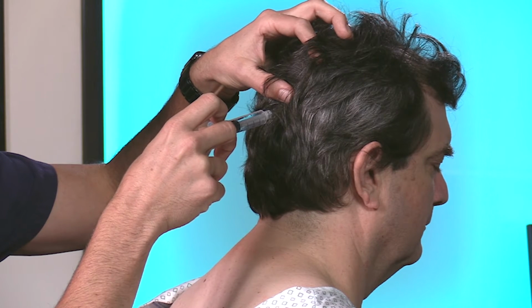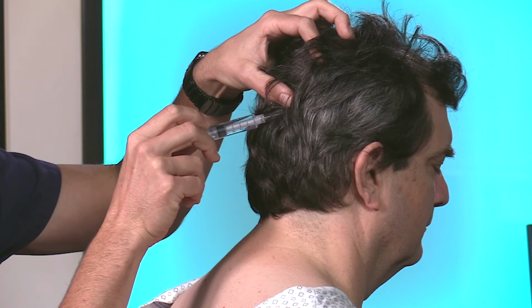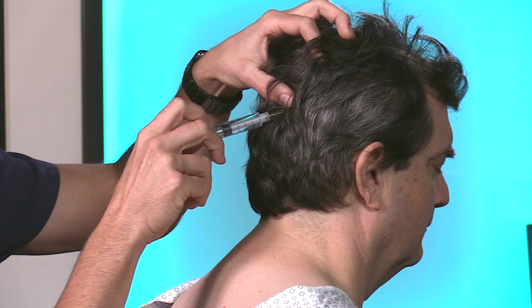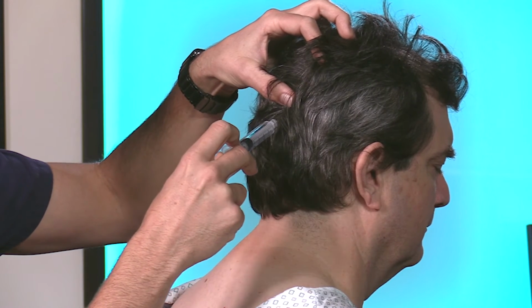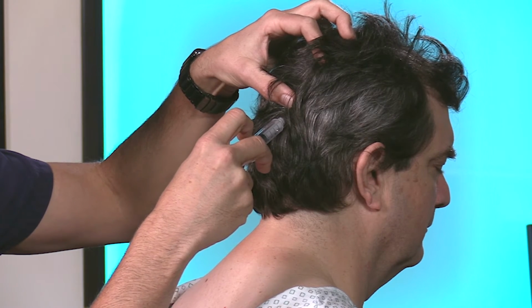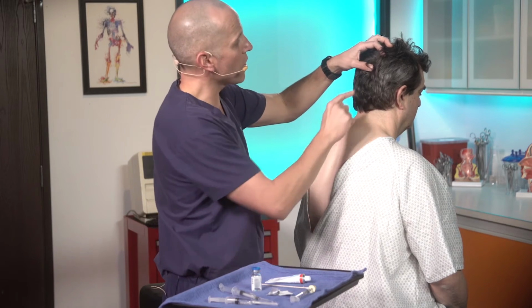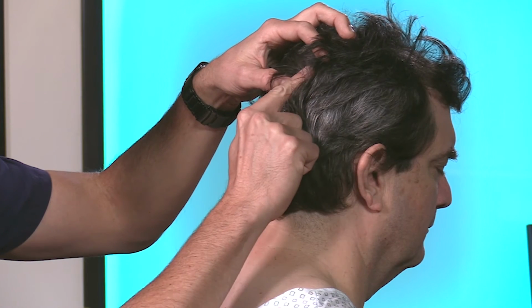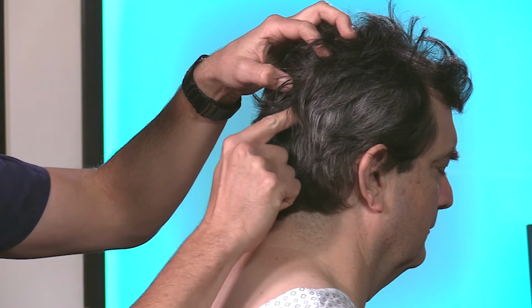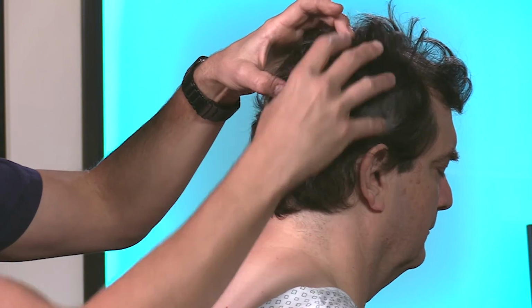of local anesthetic. The next thing I'll do is I'll pull out and I'll fan it to the right. Do the same thing, pull back, inject a little bit more, and then fan it to the left. And now what you've done is you've really created an area where this nerve cruises up in a single line, and then by fanning out, you've increased your chances of hitting that nerve before it goes up into the scalp.